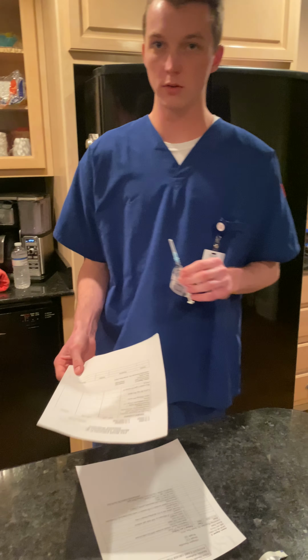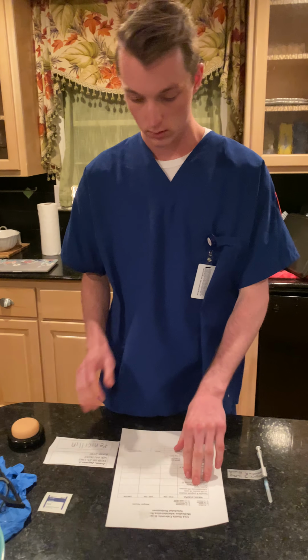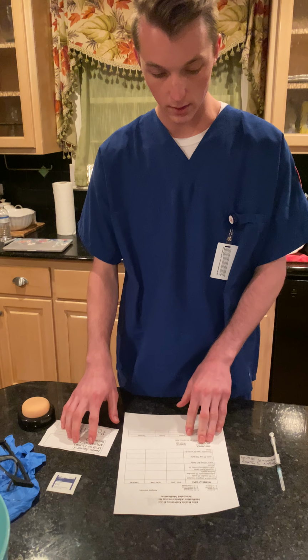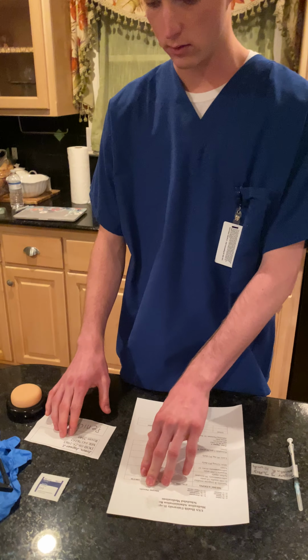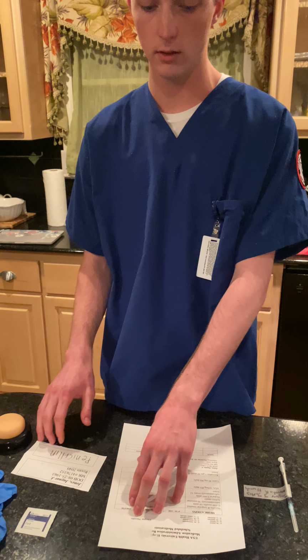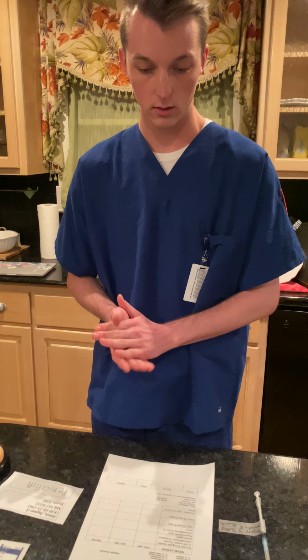And then now I will go to the patient's room. So I'll walk in, do hand hygiene, and then I will check for the 2 patient identifiers. So I have Jaguar J. Jones. Date of birth is 08/25/1963, and he has an allergy band for penicillin, and the MAR also has penicillin as an allergy. So I'll ask if he has any other allergies, and he does not.